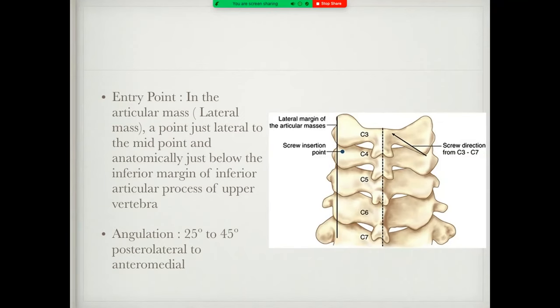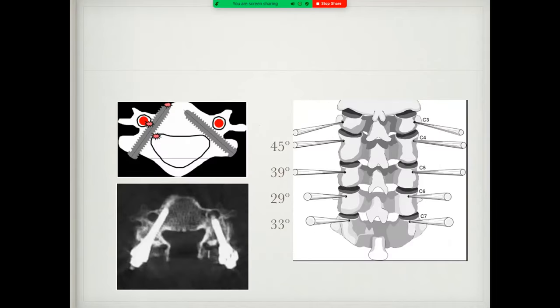Now, if you start from here, you are actually blind because you do not see anything anteriorly. So the vertebral artery is very close, like Sanjay was talking about in the morning. The vertebral artery is very close because the pedicles may be pretty narrow. So you have to be very careful. Steering is important. Otherwise, we have to take one wall of the pedicle in our view. That is important for the technique. Otherwise, you may breach the vertebral foramen or the vertebral artery.